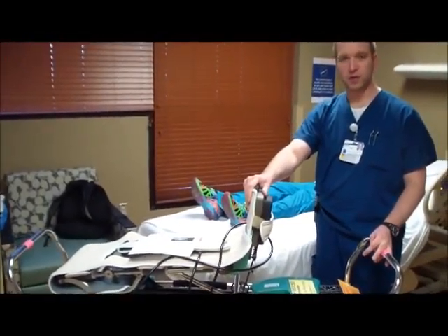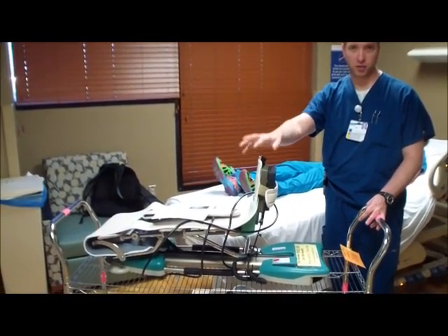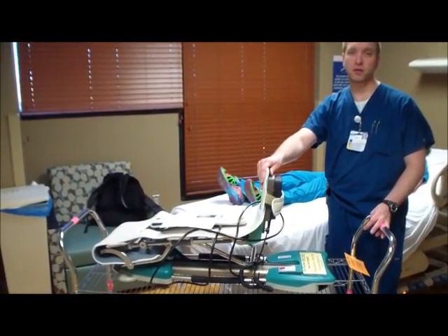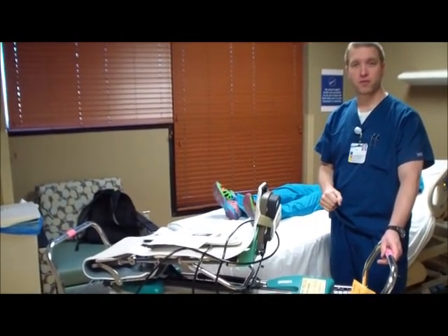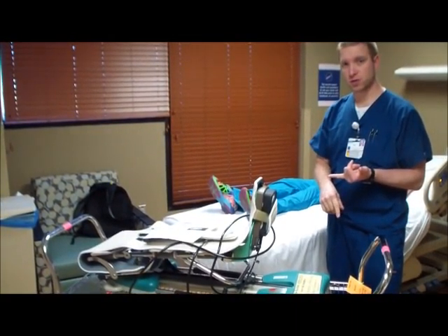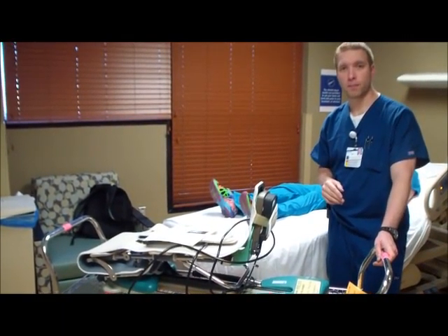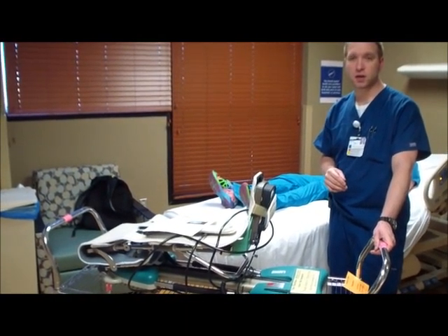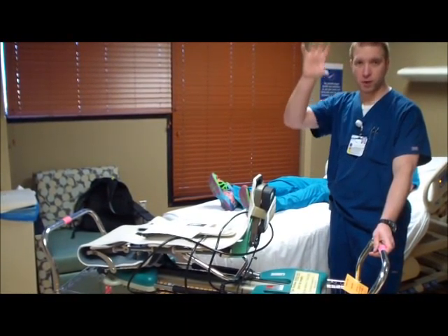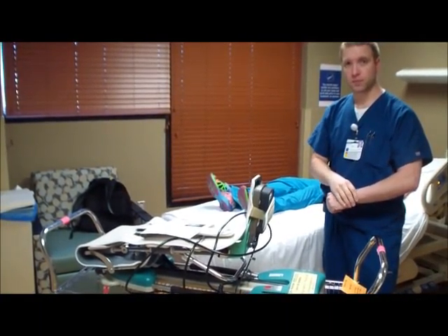And you'll typically have 2 on there just in case you find another patient down there, or it's a bilateral total knee replacement. So once you have all this information about the patient, you have your CPMs, you'll want to go ahead and go down to our PACU location, post-anesthesia care unit, and there's a button on the wall. All you need to do is hit that button and the double doors will open for you.